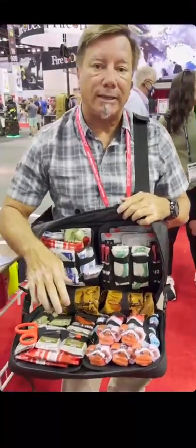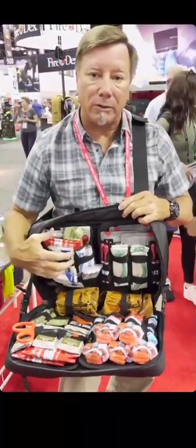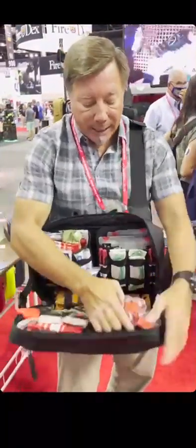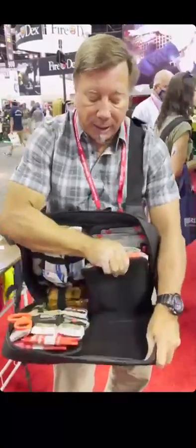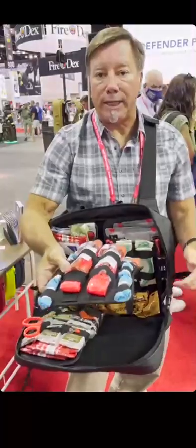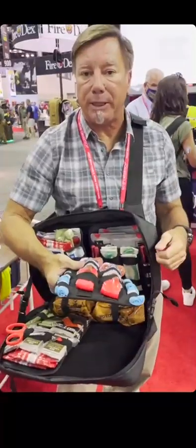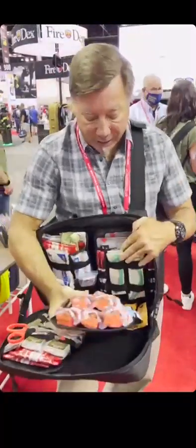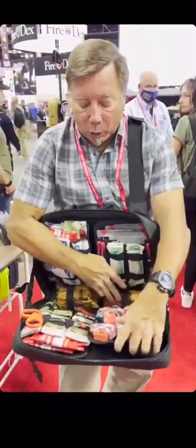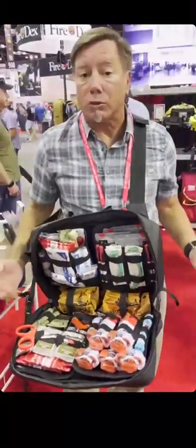Another way you can set this bag up is to use four identical panels, set each panel up the same way, and then those panels become a rip-away throw-and-go kit. I can be moving, drop these down at a casualty, and someone else can come up behind me to work. So you can set it up as a tactical medic configuration or as a throw-and-go kit.